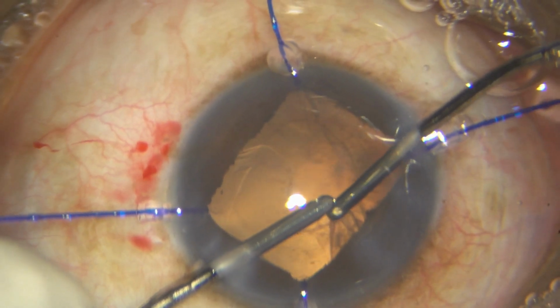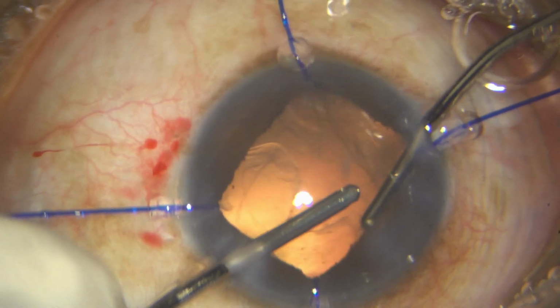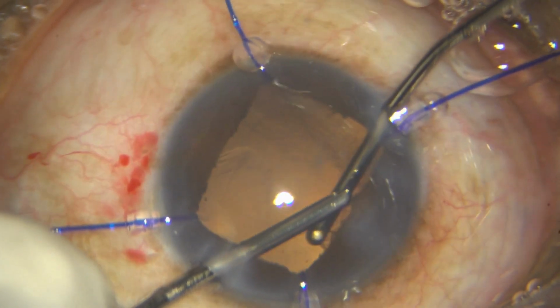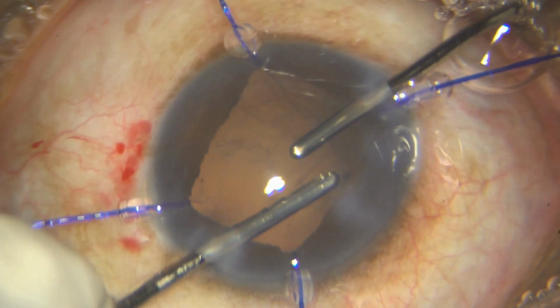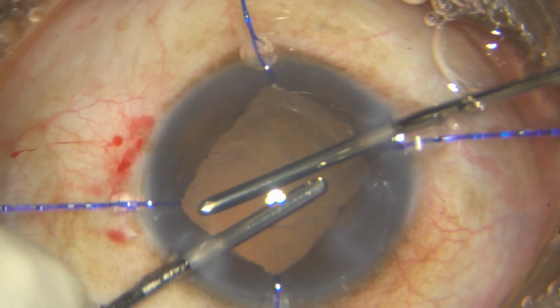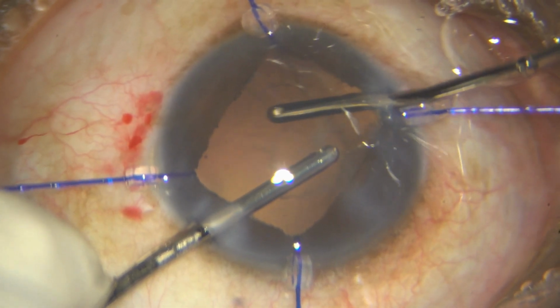So it's in these cases that you have to be extremely careful. Don't go with very high parameters into the fornices. You will definitely catch the PC and bring it out. So I'm almost going in my polishing mode to the fornices, just engage the cortex, bring it out, and then once I'm in a safer zone, I go back to my aspiration mode, aspiration parameters, sorry, and aspirate that cortex.